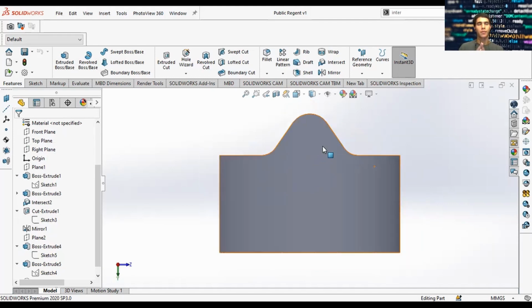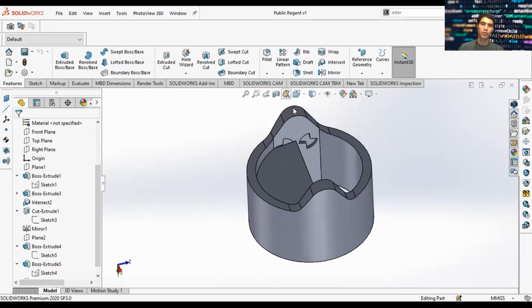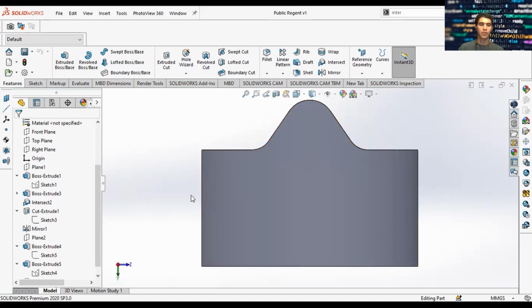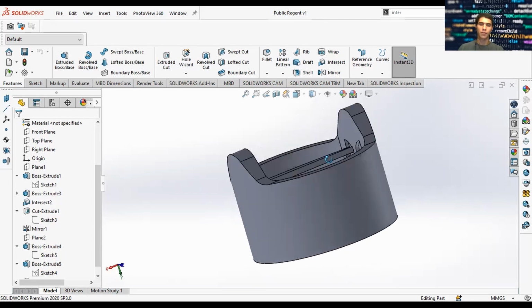So we know from the profile, from the specs given to us, that the entire valve is 13.7, 13 millimeters tall. So from beginning to end is 13 millimeters tall. And that includes when the leaflets extend outward. So this leaflet right now is closed, and blood flow would go through these leaflets and it would fold like this downward. So here what we're going to do is we're going to create a new sketch, and we're going to extrude so we can get the final shape of the valve.